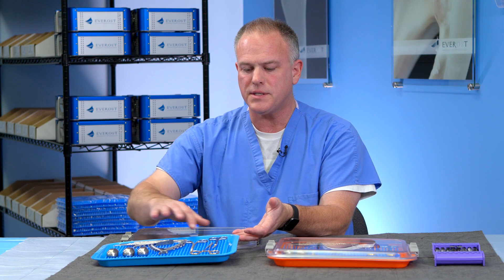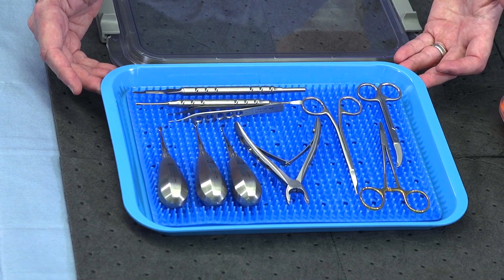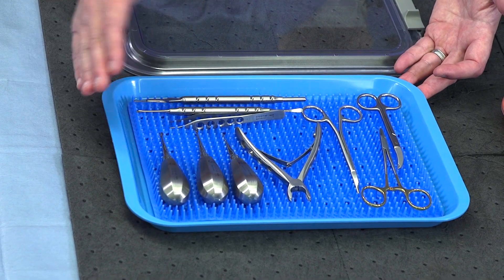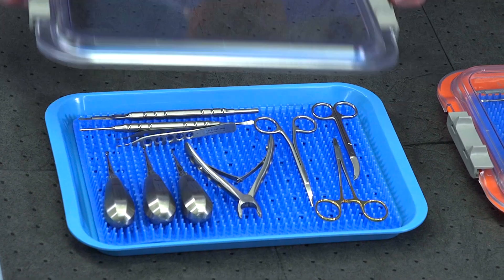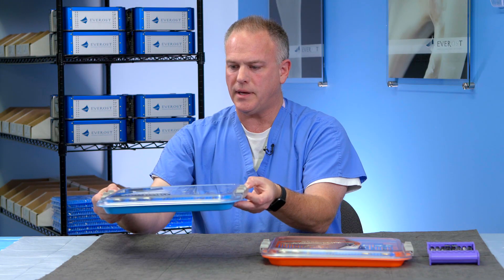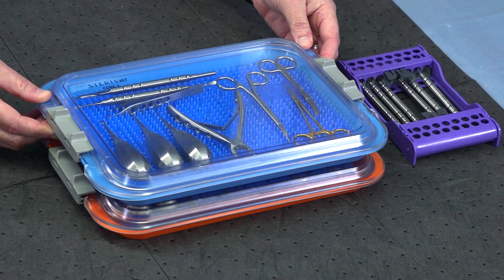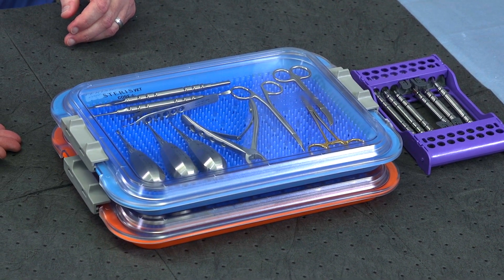When the procedures are over, the silicone mat which helps to organize the instruments can be easily cleaned so that we can prepare this for the next set of procedures. With the lid put onto the tray and locked down, we can take our oral surgery kit and stack it and make sure that all of our instruments are properly organized on the shelf.